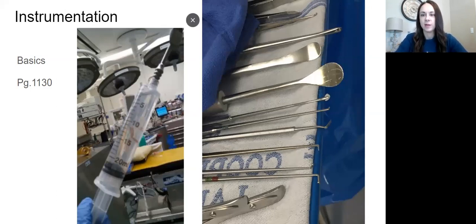After that, you can see that there are some curettes and other small elevators over here, but you need to learn all of your bone instruments, spine and for crani. What was good for me learning neuro instruments is a lot of them go hand in hand. So I learned spine first, and when I started doing cranies, I already knew most of the instrumentation because it's the same or very similar.